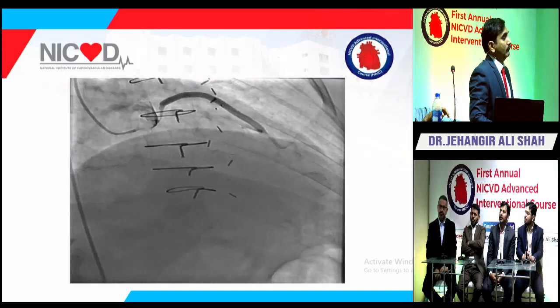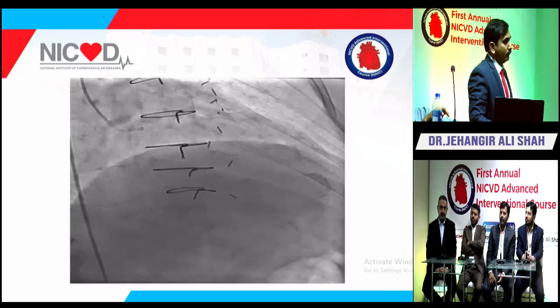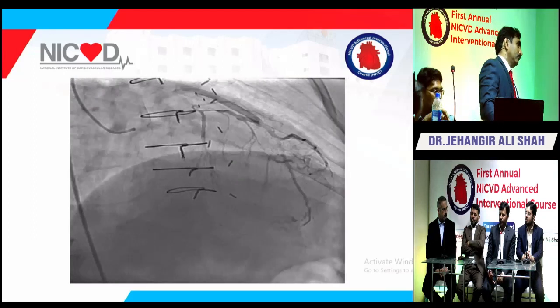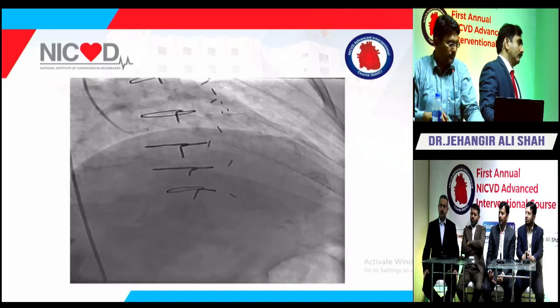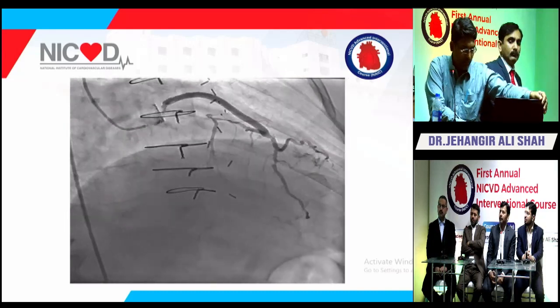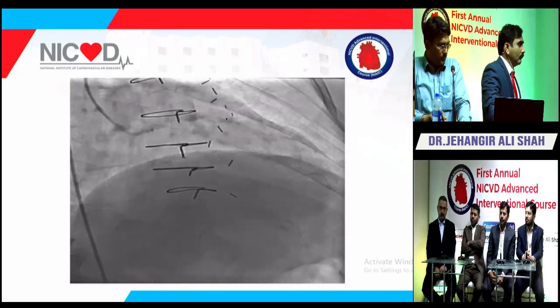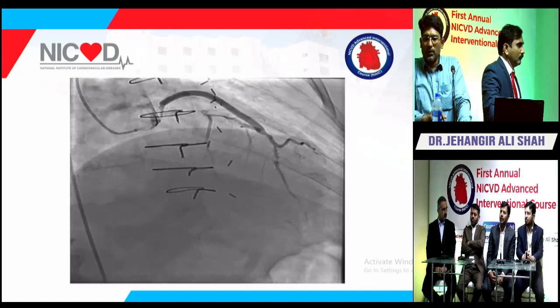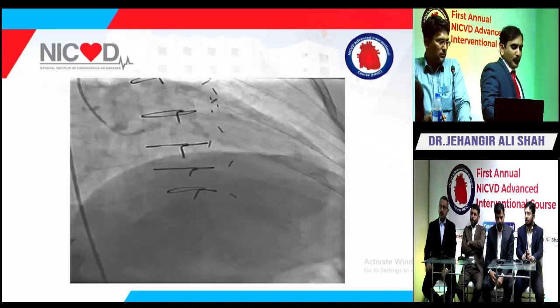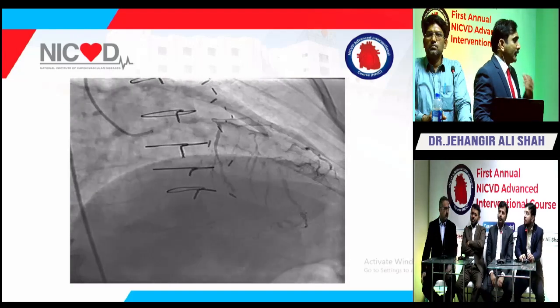And it's calcified. If I go with the intervention of the native LAD, it requires a lot of fluoro time and dye. Considering this, the aorto-ostial SVG is easy to intervene, so I'll proceed with PCI of the SVG to LAD. What about Dr. Ammar? What would you say after looking at this angiogram?